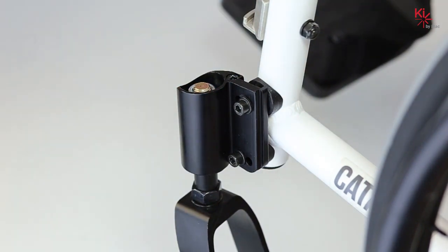Locate the adjustment screw on the top of the caster housing. Using your five millimeter allen key and turning this screw clockwise, the casters will move forward away from the chair. Turning the adjustment screw counter clockwise will move the casters rearward towards your rear wheels.